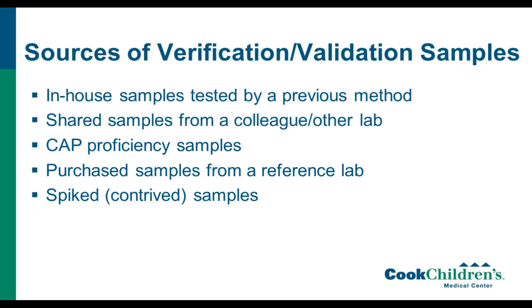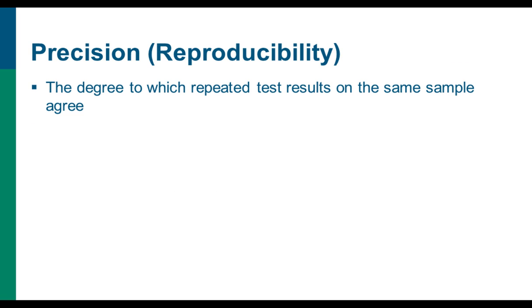And then you can also spike samples as well. I would not recommend doing your entire validation verification using spiked samples because it doesn't as closely mimic human specimens, but a combination of these can be used.